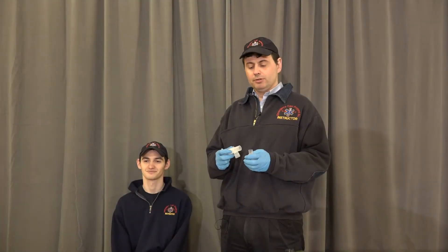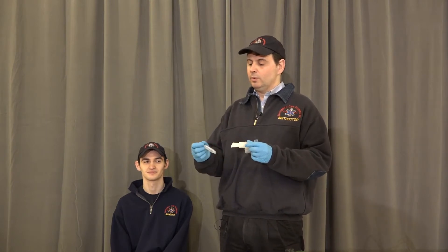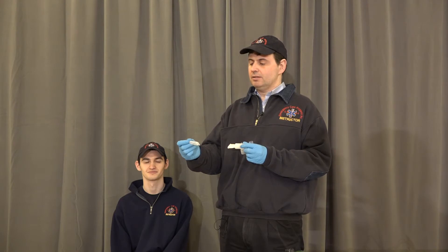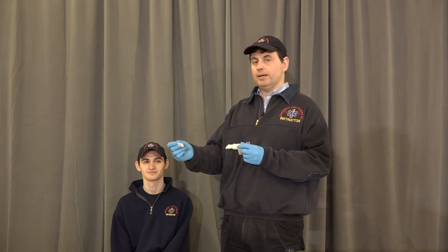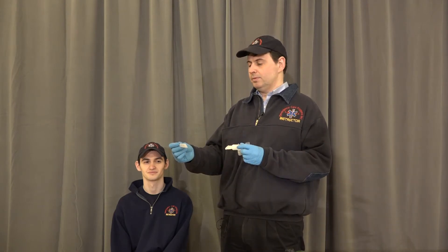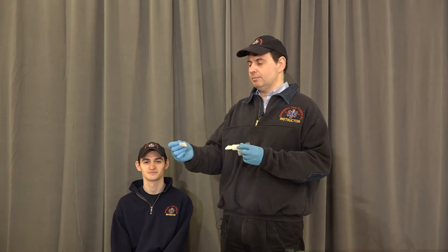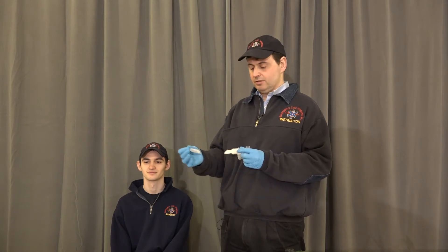Administration of albuterol via nebulizer with 100% oxygen. We have our nebulizer device and our albuterol sulfate, 0.083%, 2.5 milligrams in 3 ml of an albuterol sulfate solution.